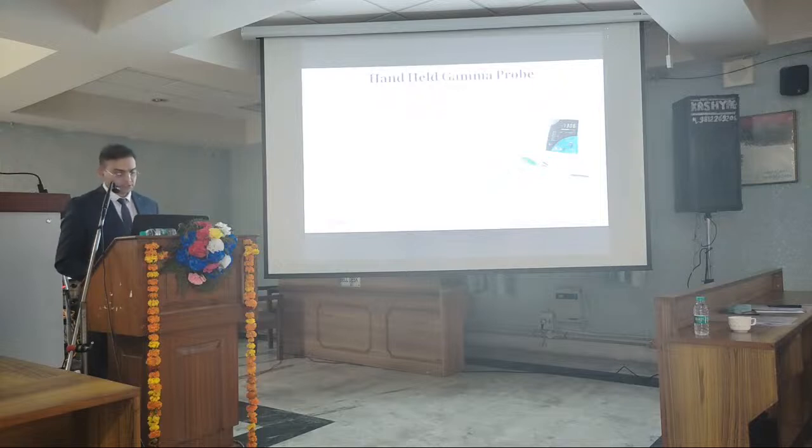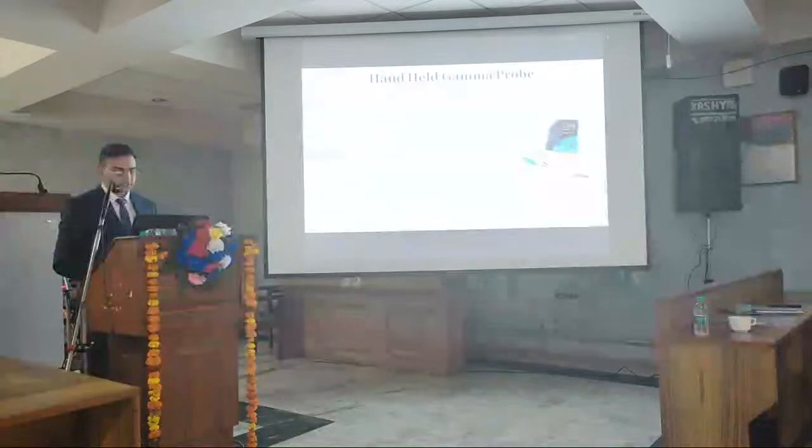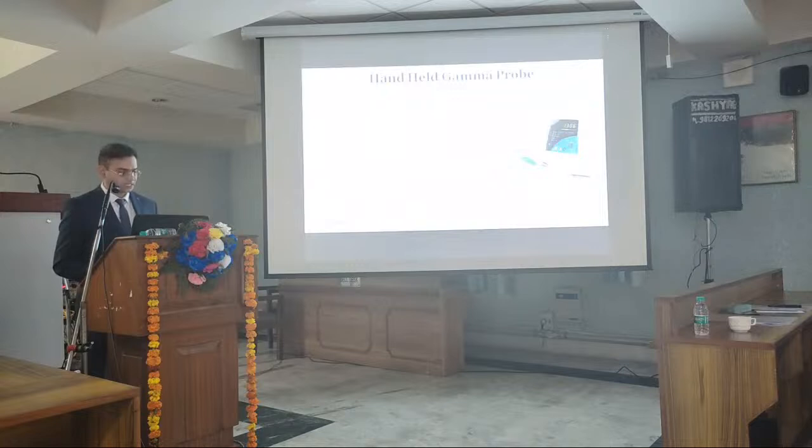The handheld gamma probe shown in the image is the typical sodium iodide probe, which is calibrated with the technetium window, and these are angled for use in various locations, like over the skin surface and also inside the surgical cavity. They should be light, well balanced, and have all electrical safety considerations.